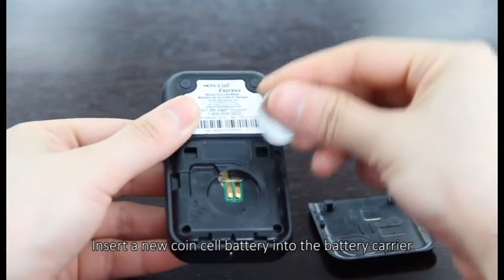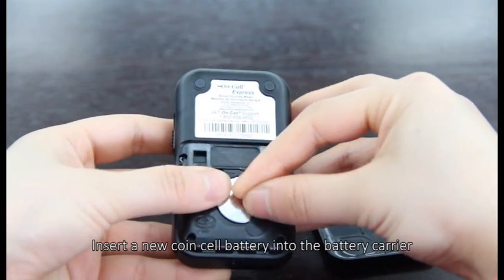Insert the coin cell battery into the battery carrier.